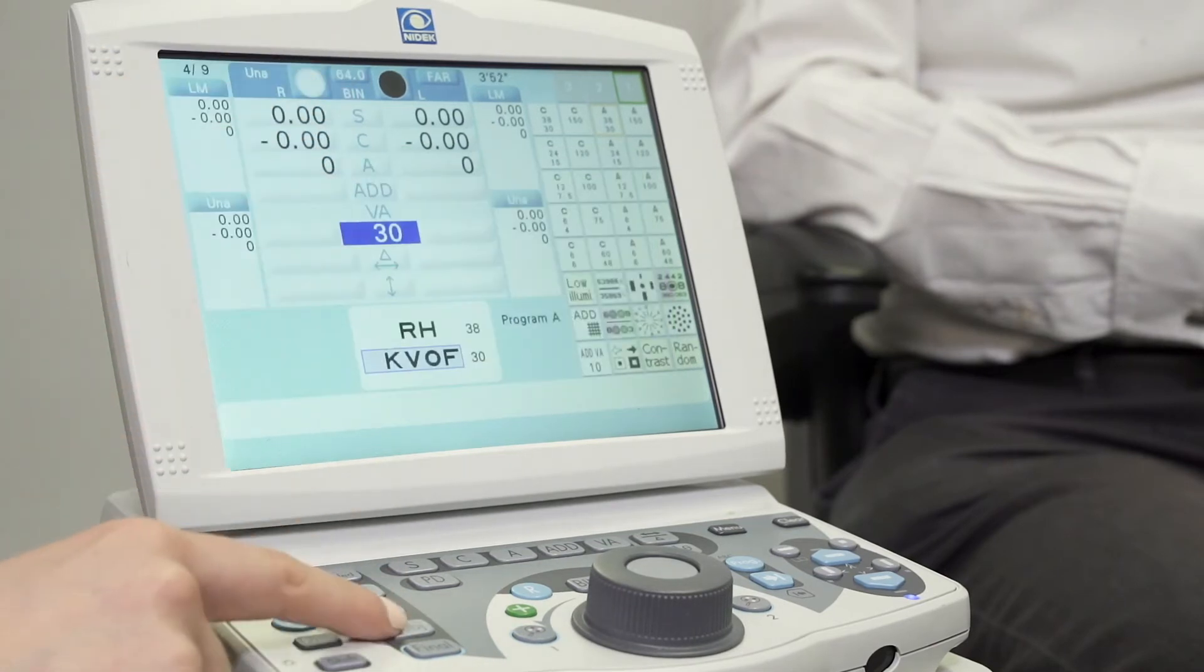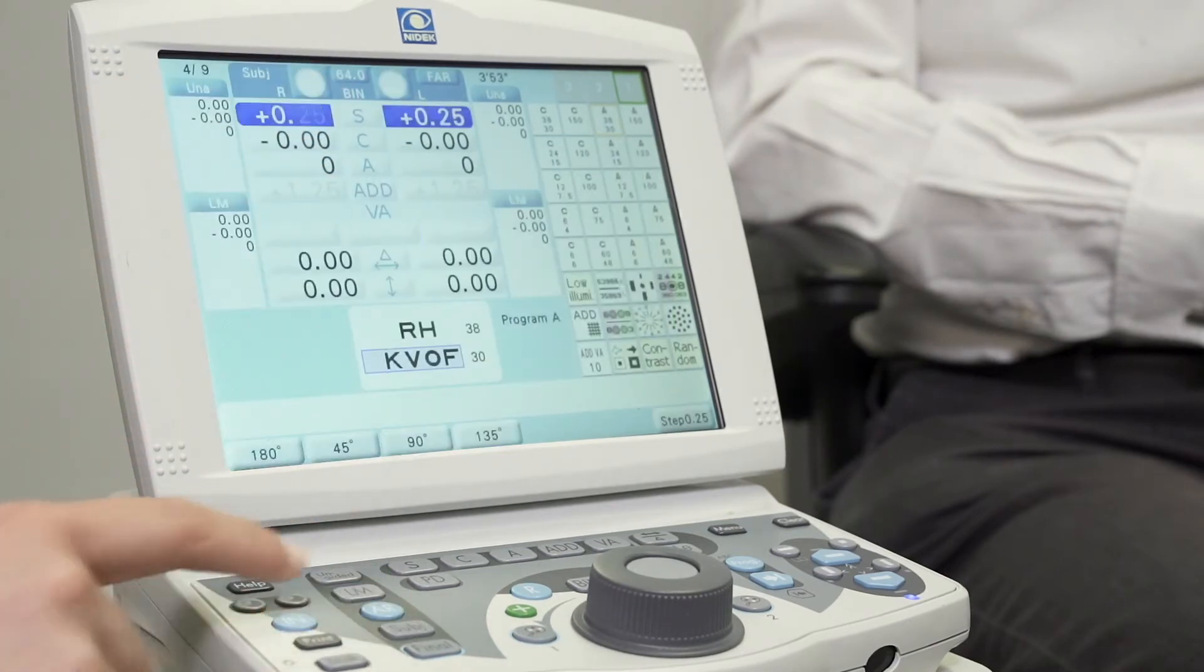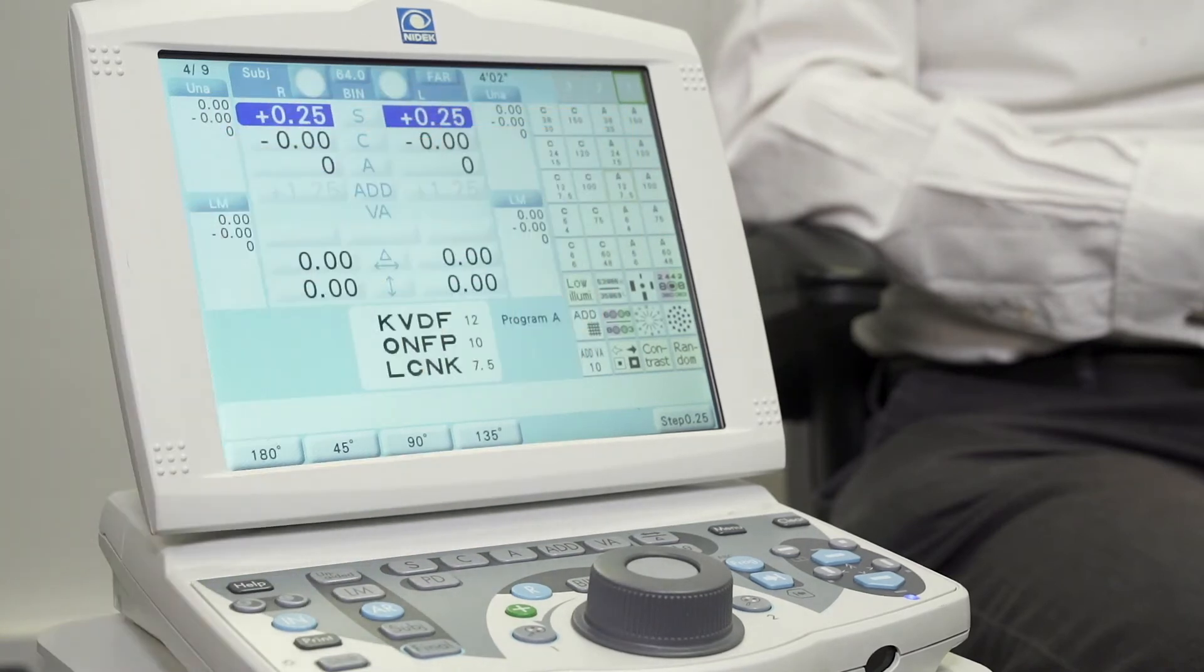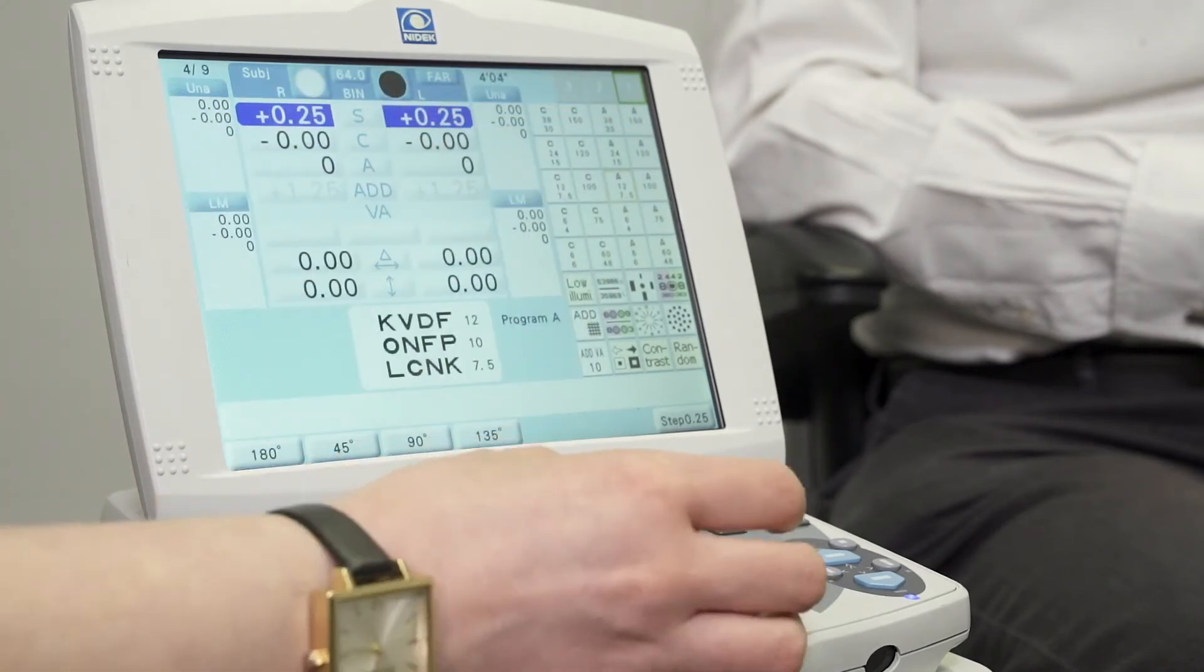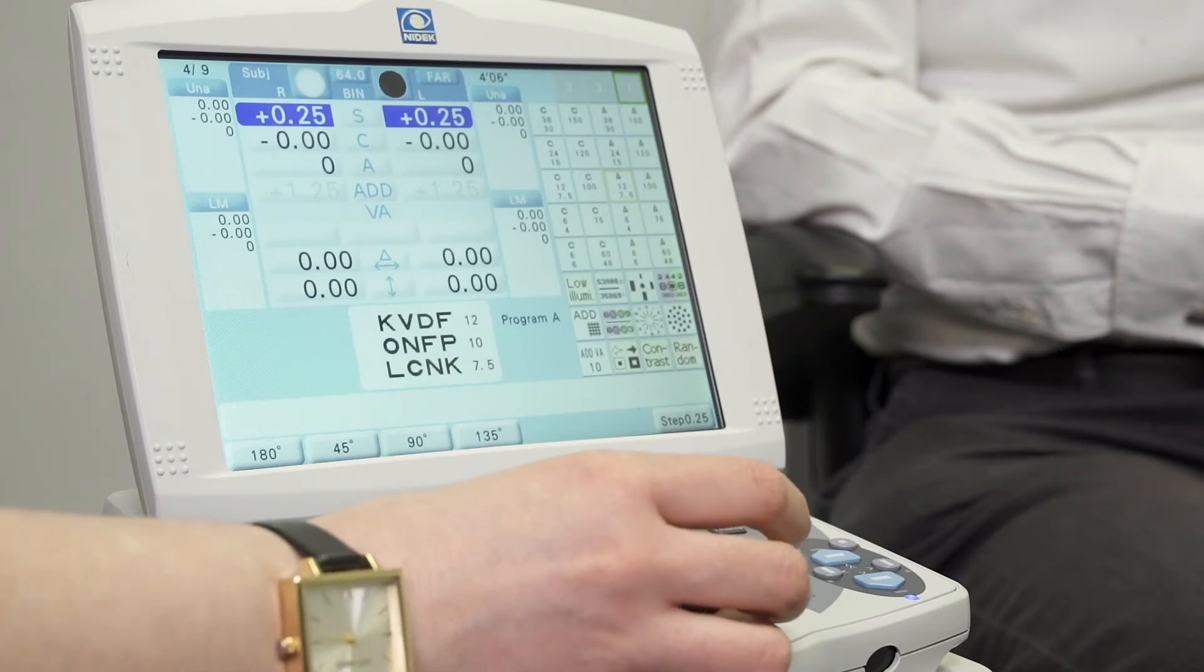Once we're happy there, we can move on to the subjective button. Pressing subjective there, we can start by trying to refine our best vision sphere. We can do that by selecting the smallest letters the patient is able to read and then offering them 0.25 steps with and without and asking which is better.